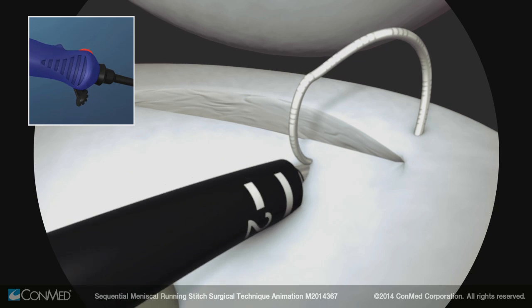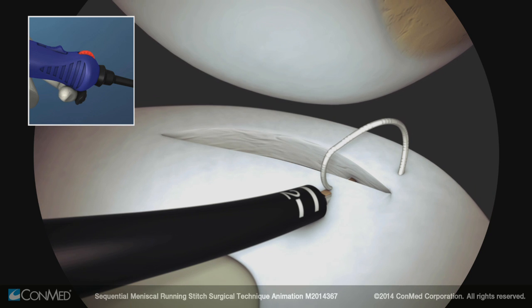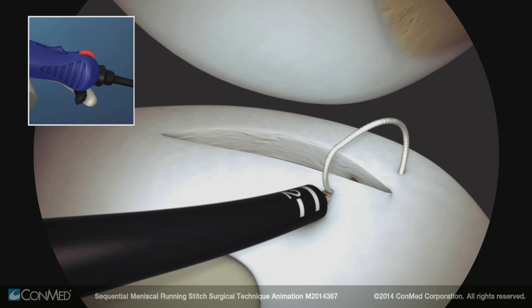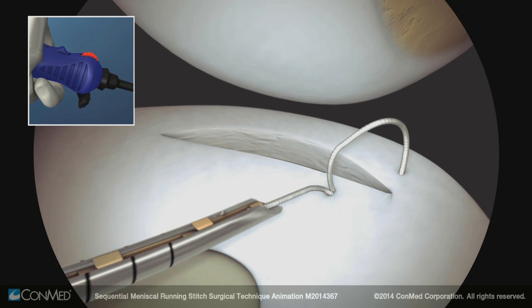Rotate the device two full revolutions, engaging the knotless fixation. Advance the trigger forward to prepare the device for implant deployment, and then pull back and release to deploy the next implant.